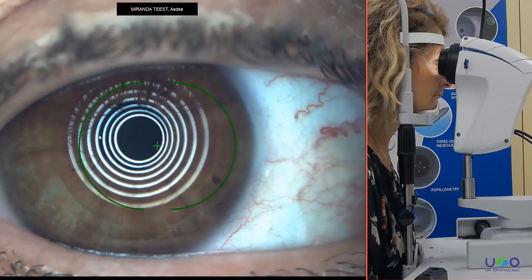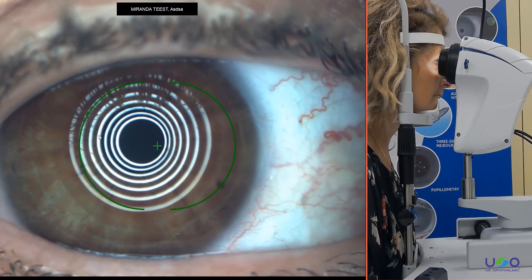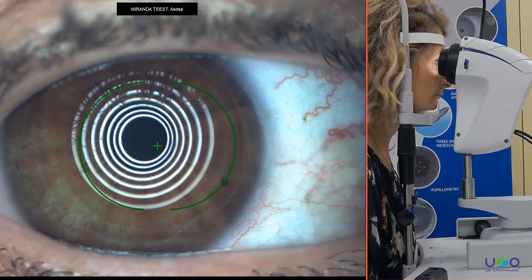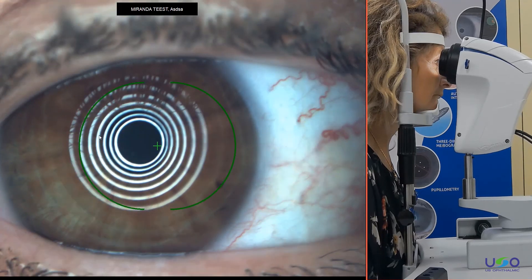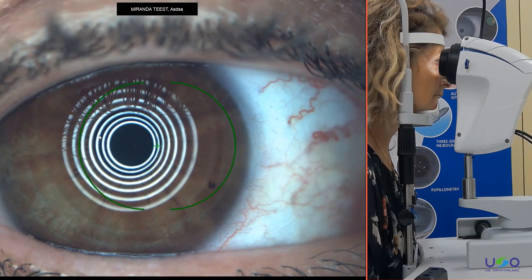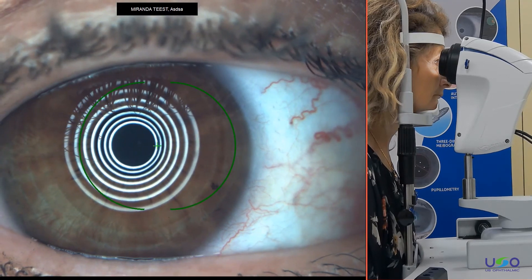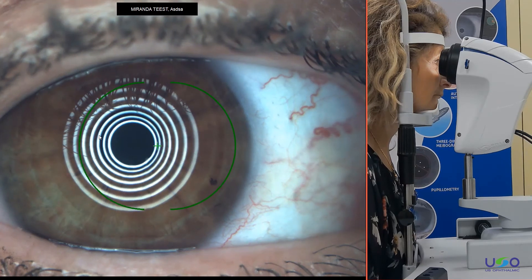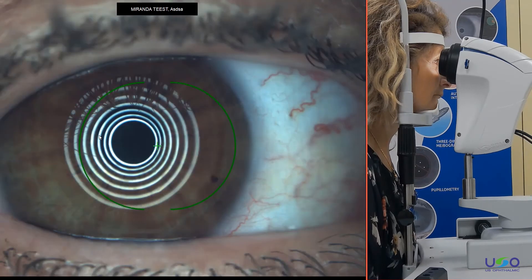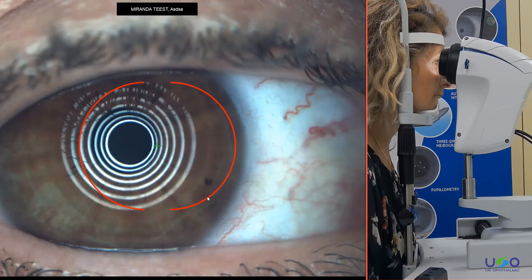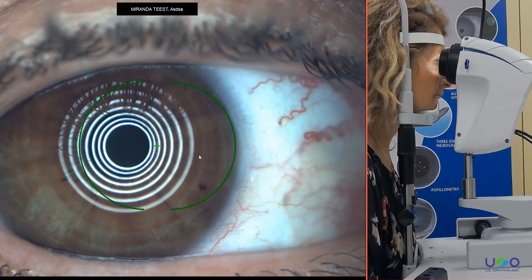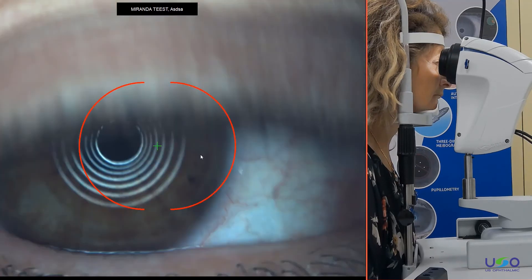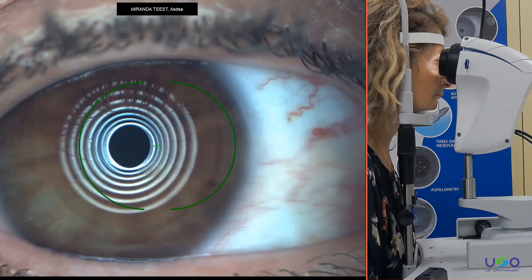So two fundamental things. The first one is the focus positioning. The picture has to be very on focus. When the picture is on focus, can you see the green circle, the two semi-circles getting green? It means that the focus of the picture is very good.